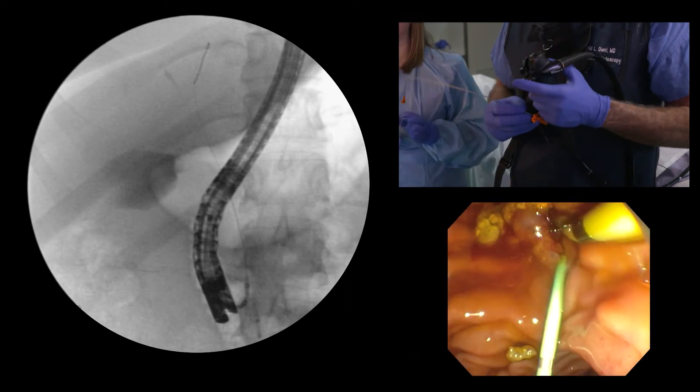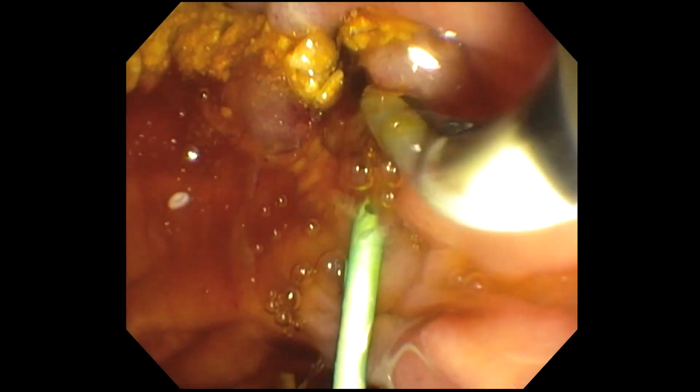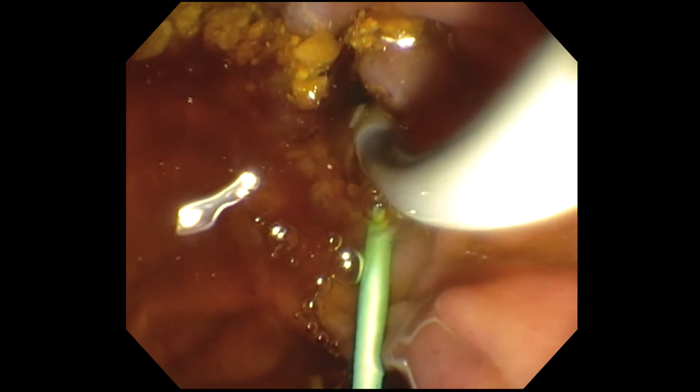So finally, I think that duct is probably clear. I'm just looking to see if any more debris is coming out. I'll sweep until there's no more debris.